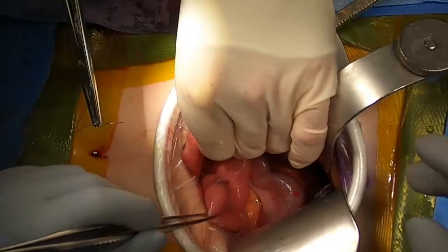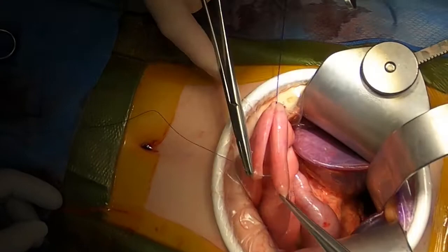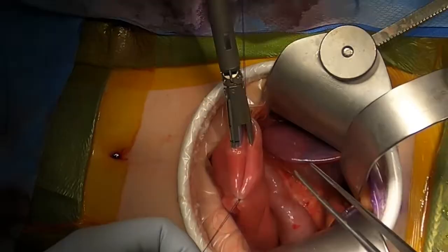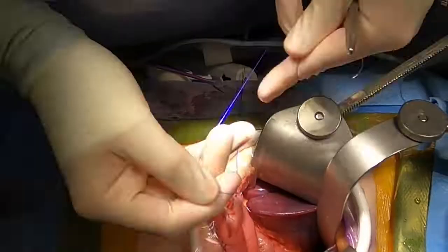A side-to-side jejuno-jejunostomy is made, ensuring we are at least 50 cm downstream of the Roux limb. Enterotomies are created with electrocautery. A stapler is used to create the anastomosis, and the common enterotomy is oversewn with a running 3-0 PDS.